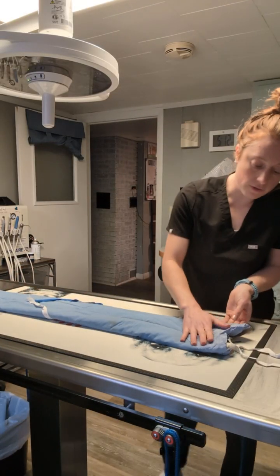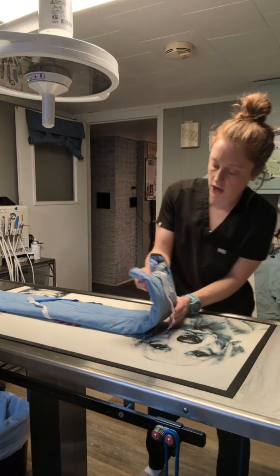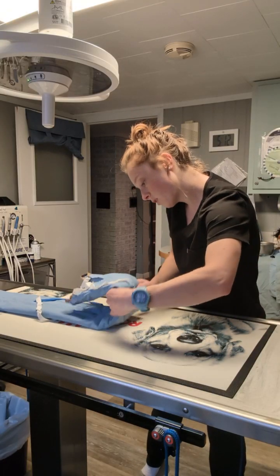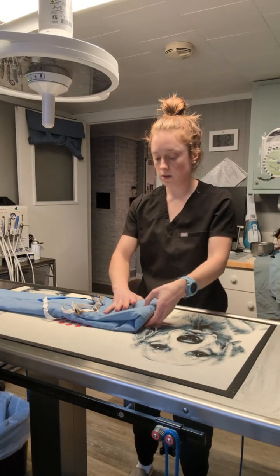Then I want to accordion fold it, keeping that back collar at the top. So I'm going to do my first fold, making sure that that is up and centered as much as possible, like that.